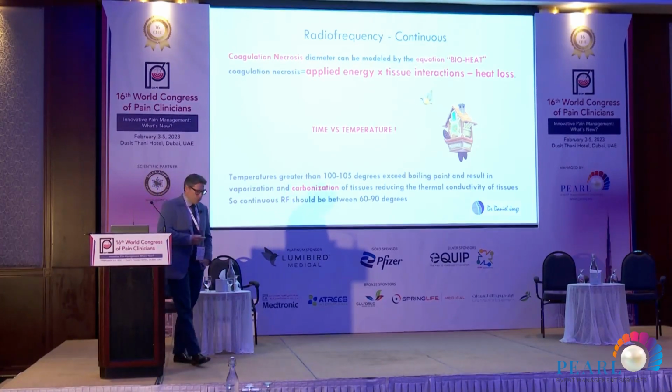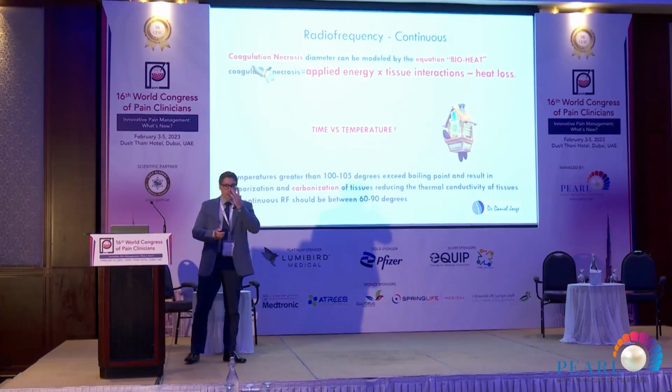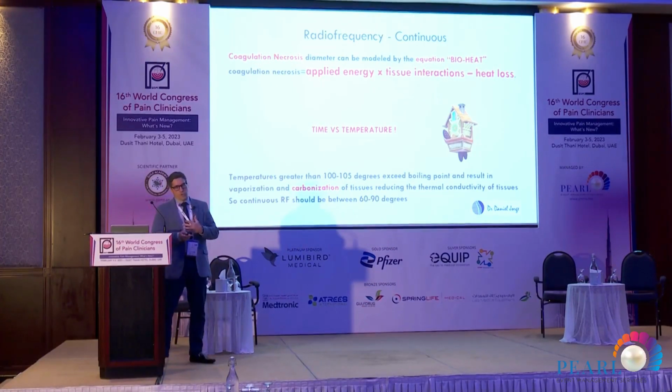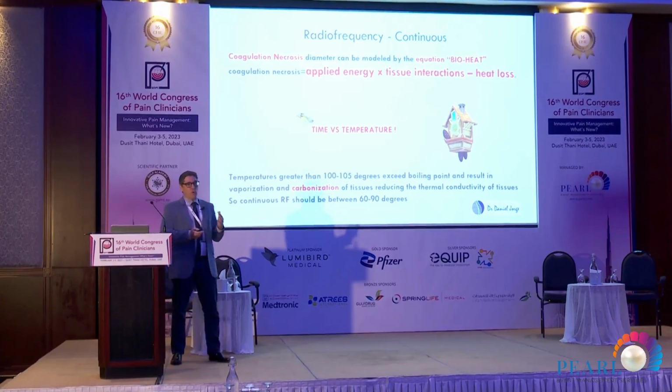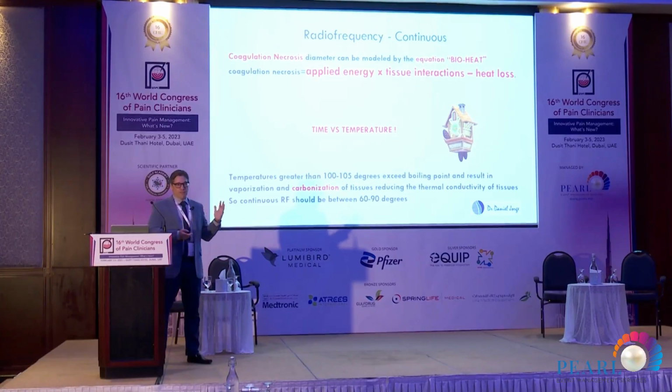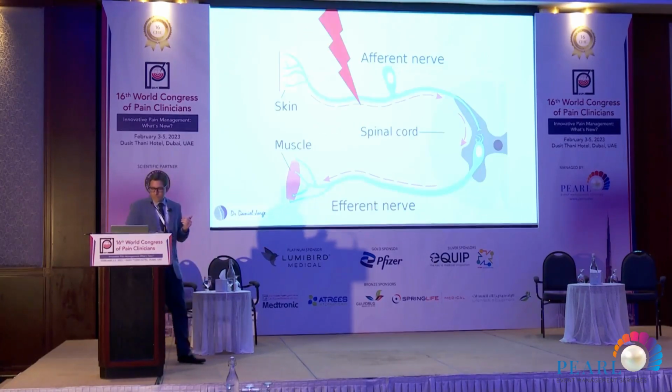When you are using the continuous radio frequency, we have to be aware of the time versus temperature, and not only how you're going to fly your needle to the target. You have to pay attention to the temperature, because you don't want to go near the boiling point, as you're going to have a carbonization of the tissue and no electric field will be useful for the cell.